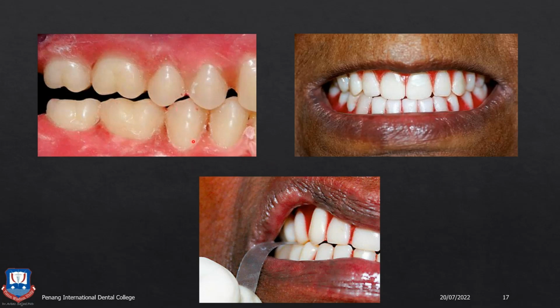Also, if there is an error in centric relationship, the midline generally shifts to one side after the patient closes, and then suddenly the jaw deviates to one side and the midline does not match. So this will give you an idea that there was an error in the recording of centric relationship. So this needs to be corrected by taking a new interocclusal record between the upper and lower teeth. In this case, when there's an open bite, you can put softened wax here between the teeth, and you take a record of that side, and then you re-articulate the upper and lower teeth setting with the models. But for this, you have to make sure that your record bases are stable. Otherwise, you will again keep getting errors.